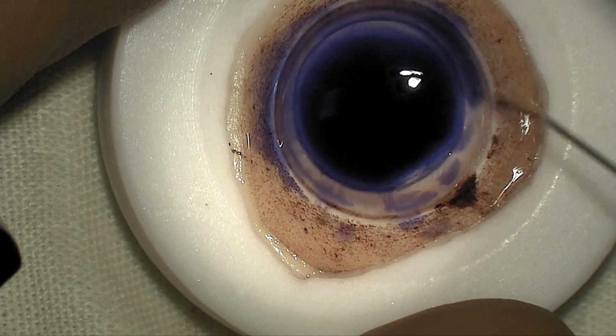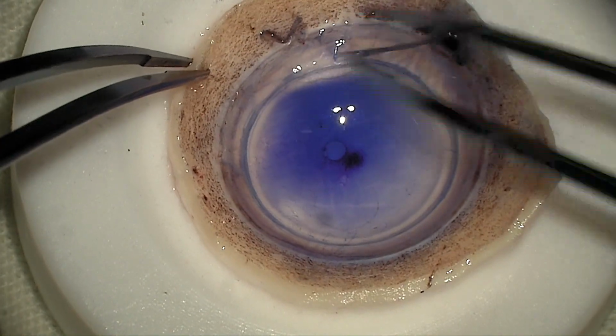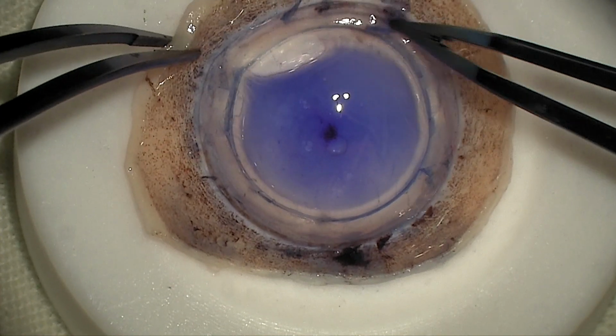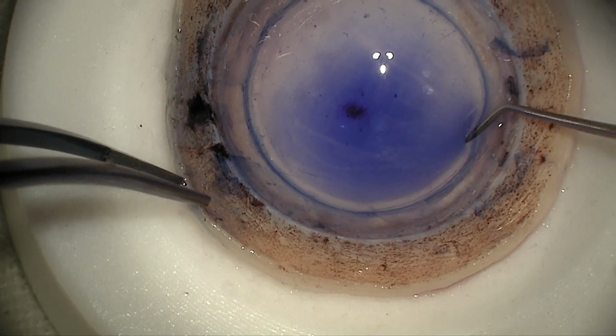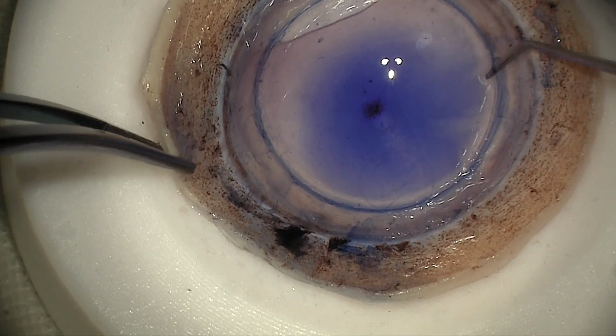The tissue is first placed on a Teflon block with the endothelial side up, and a 9.5 mm partial trephination is done. It is then stained with trypan blue to identify the cut margins. The peripheral DM beyond the trephination is then stripped off. The DM endothelial edge is carefully identified and loosened all 360 degrees with an elevator instrument.